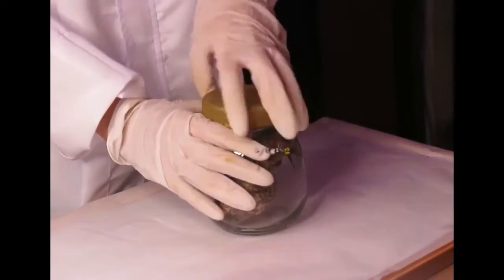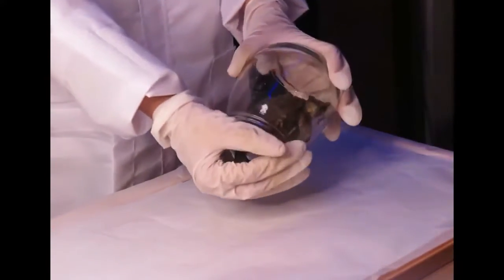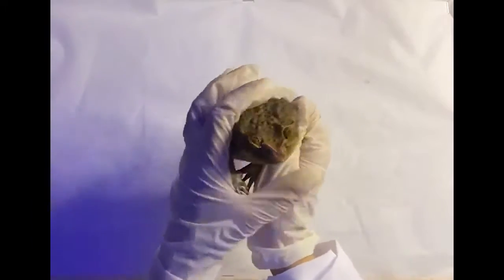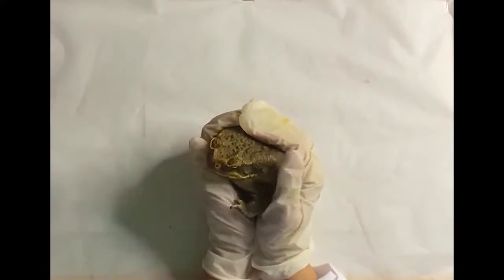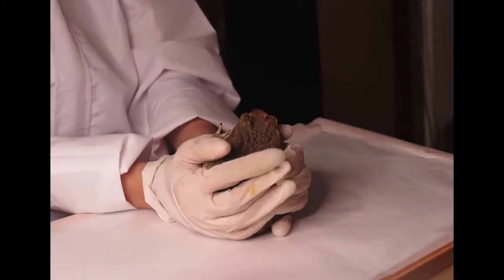So now, we are going to be pithing the frog. So let us take our specimen out of his container first. Now, I am trying to calm him down since he is not exactly behaving the way we would want him to.